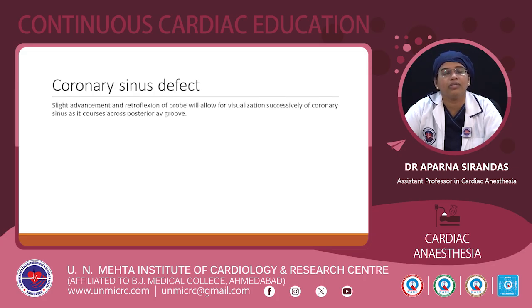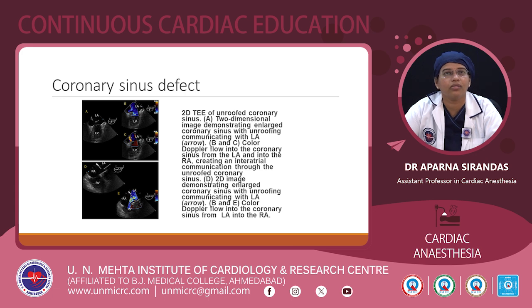Coming to the coronary sinus defect, slight advancement and retroflexion of the probe will allow for visualization successively of the coronary sinus as it courses across the posterior AV groove. In this you can see the figures. It is a 2D TEE of unroofed coronary sinus. It is demonstrating a 2D image with enlarged coronary sinus with unroofing communication with LA.